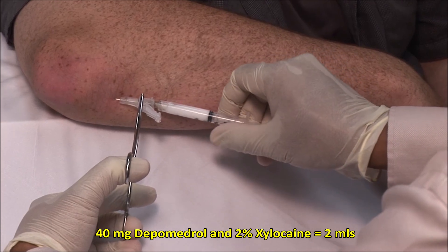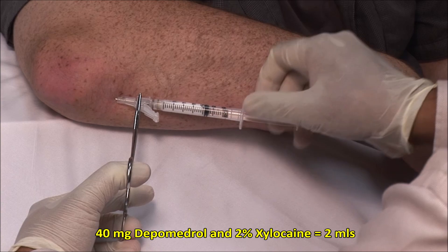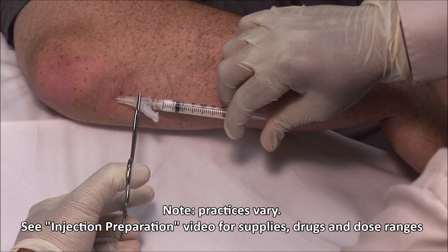Here I am injecting a mixture of 40 mg of depo-medrol and 2% xylocaine made up to a volume of 2 mls. It should go in freely.